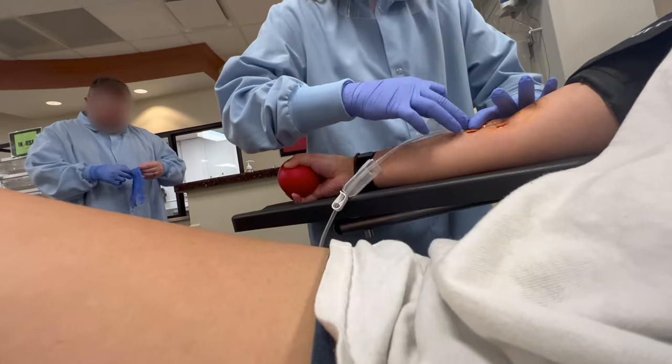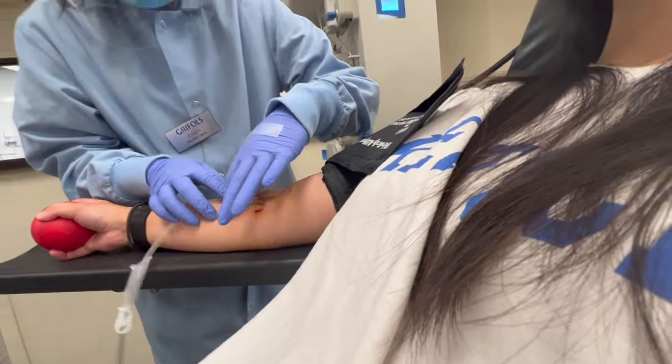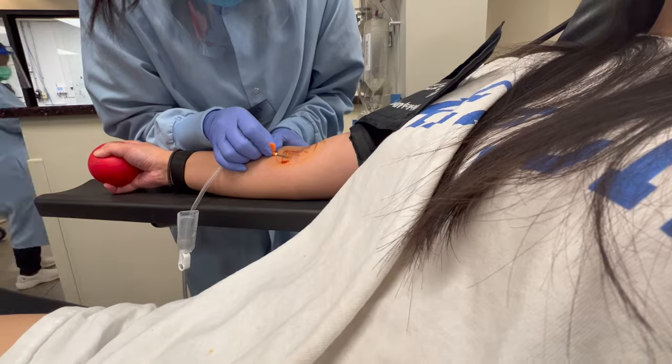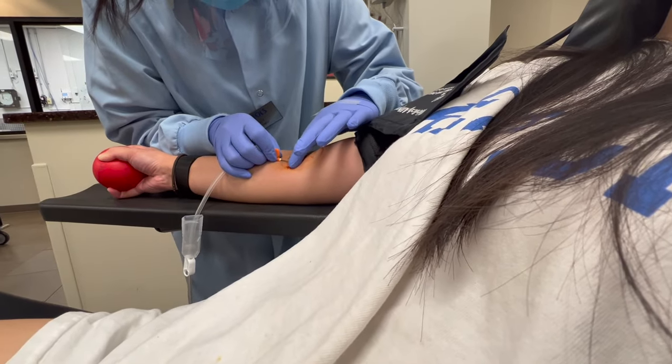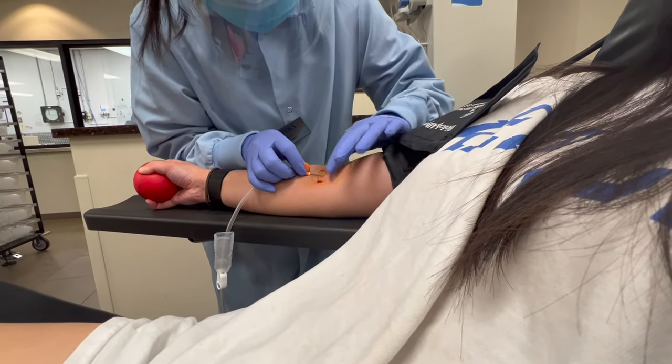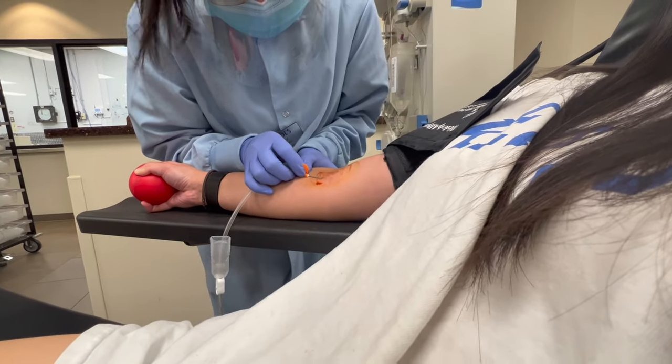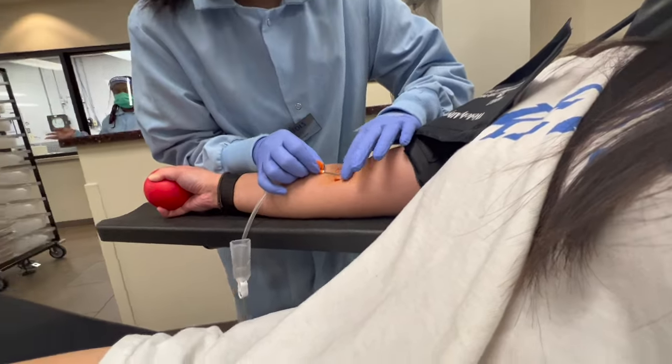A second phlebotomist came in, looked at my arm, and felt around the vein. Unfortunately it was just not a good location for the stick after moving it around, so they decided to take me out, give me some ice on my right arm, and set me up using my left arm instead.